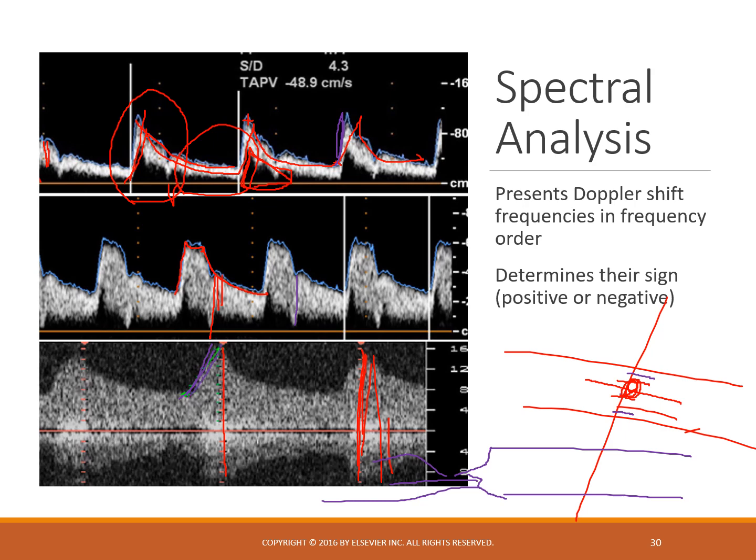Okay. Now I have less blood here than I had here, and I have vessels down here that still want to be fed, so they're going to have a very low resistance. So my blood flow is going to continue forward flow through easily to that tissue bed. Low resistance because of the decrease in blood volume or pressure in this post-stenotic area.